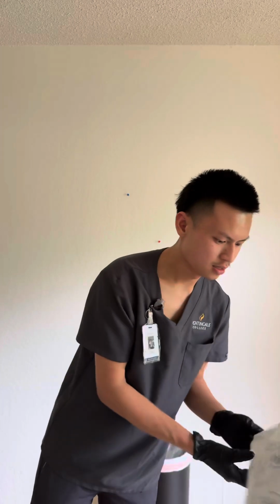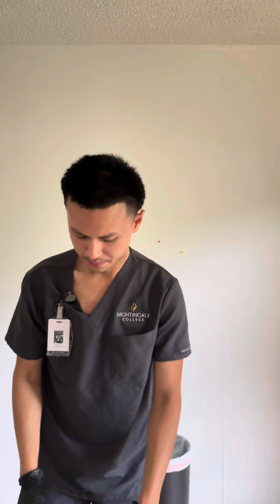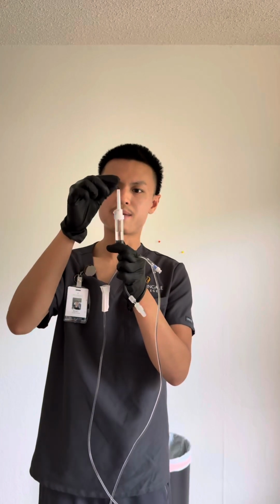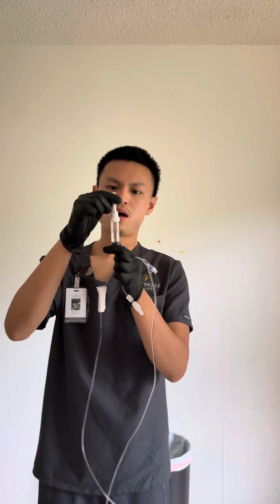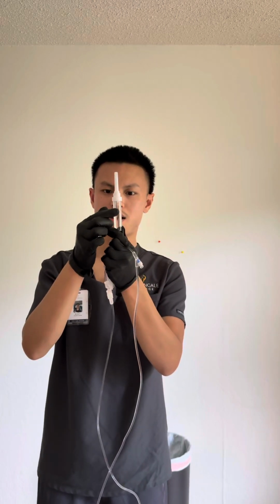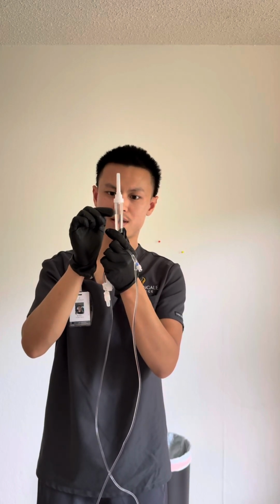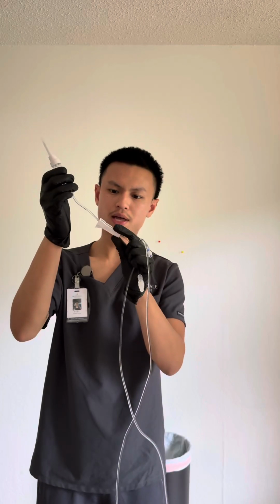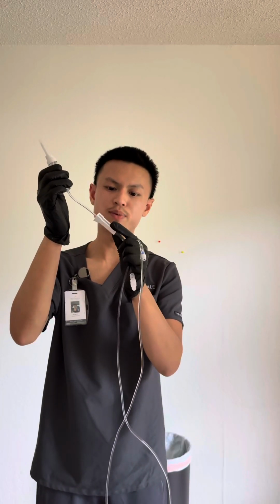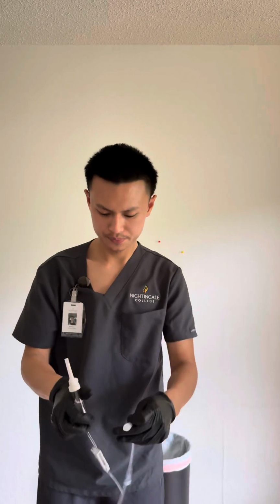For my supplies, I have my primary tubing and the secondary tubing. I've already opened it. With my primary tubing, I have the spike. I'm going to have the cap on just to maintain sterility until I spike it. I have the drip chamber, which is going to fill up halfway with medication, and I will be counting the drops. I have the roller clamp, and this is to be in the off position so that fluid does not flow out. I have my Y site as well as my adapter.